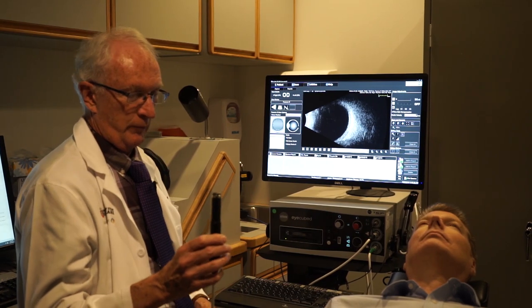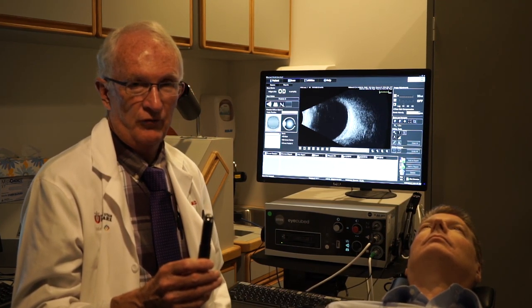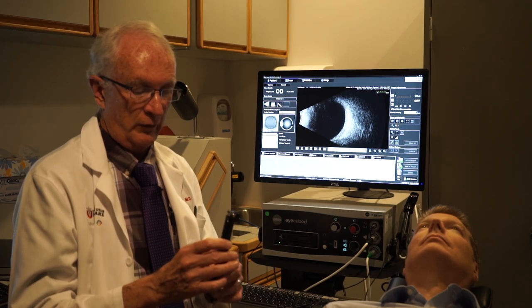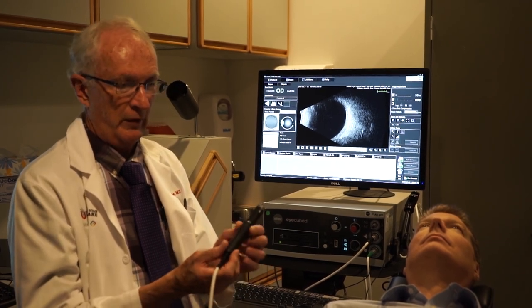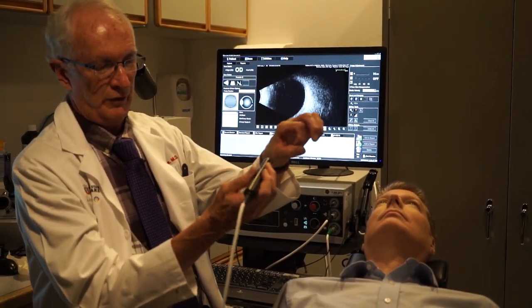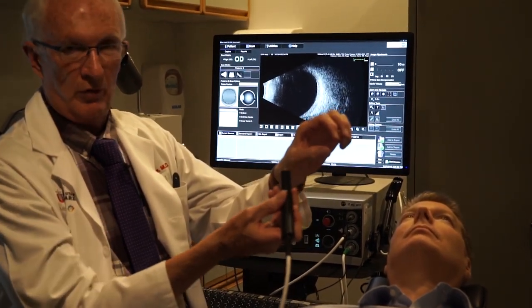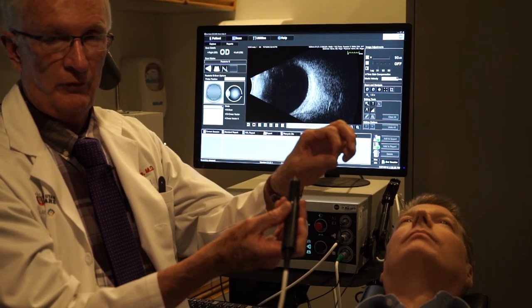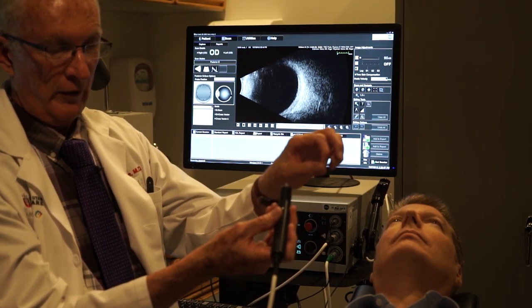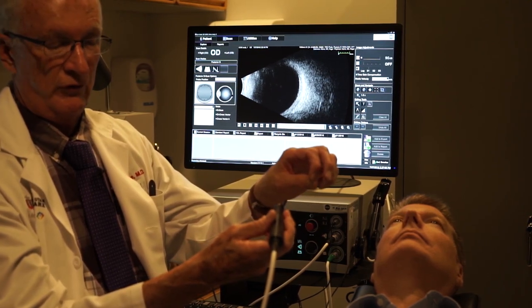There are two major probe positions we use. One is called the transverse position, where we hold the probe parallel to the limbus. The transducer goes back and forth parallel to the limbus. Whenever I'm parallel to the limbus, whatever position I hold the probe in, that's called the transverse position.